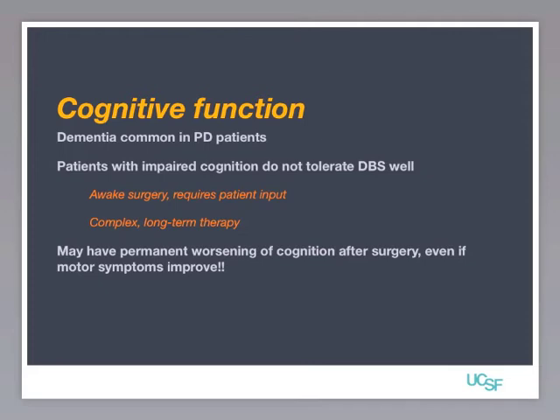The real big concern, however, is that we know that brains with memory troubles don't like to be poked with electrodes. And they particularly don't like to be poked on both sides of the brain at the same time. And early on, when we were doing DBS, we would implant just one side of the brain at a time. As we got better and the techniques got faster, we started putting both electrodes in on the same day. And we started to see a subset of our patients have significant memory problems, a lot more confusion right after surgery, and actually long-term memory difficulties after surgery.